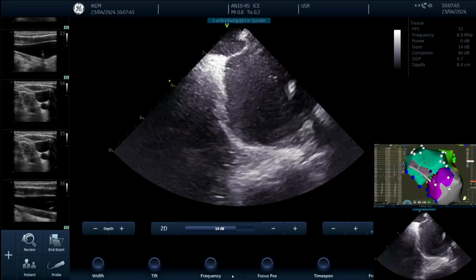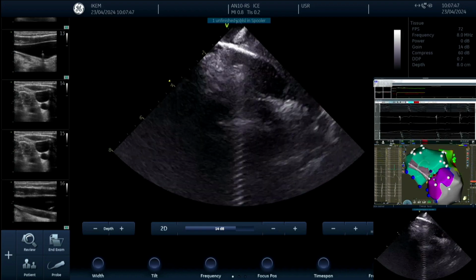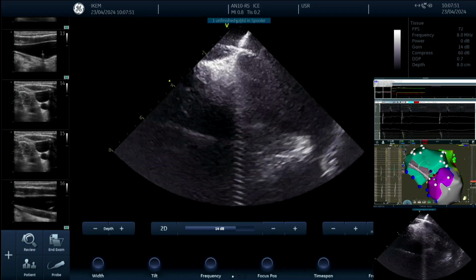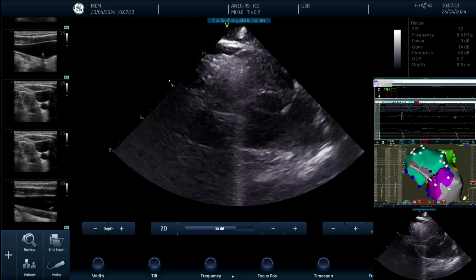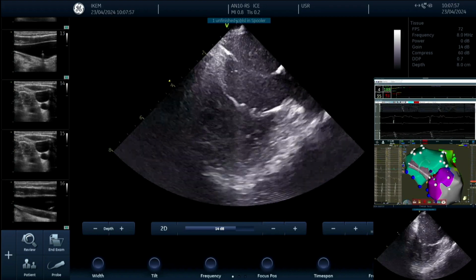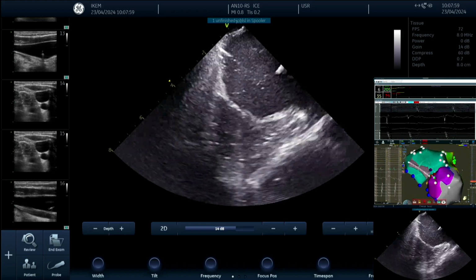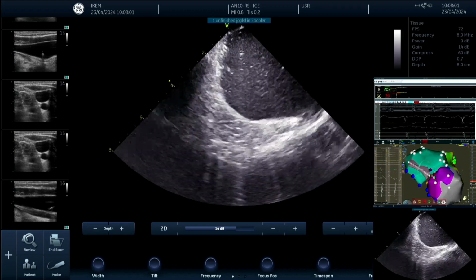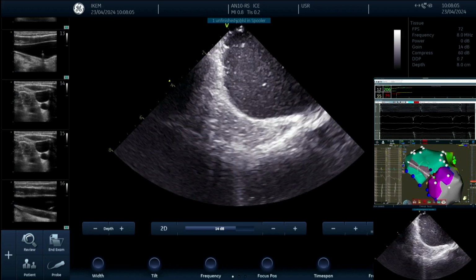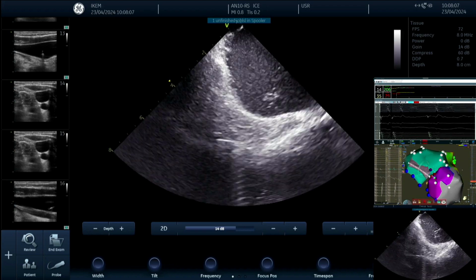But now it's also a very interesting clinical study, or we can do clinical studies with thermal energies versus PFA, because PFA, as already said, does not harm nerves compared to thermal energies.